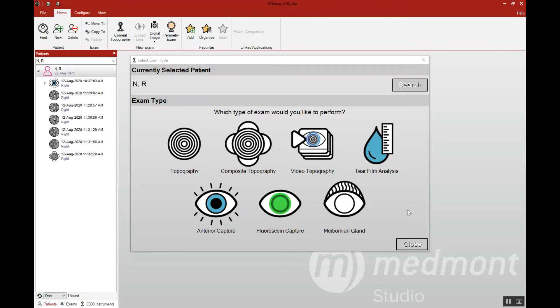This video reviews the tear film analysis that you can perform with your Medmont topographer. One of your options is the tear film analysis, a non-invasive option for assessing the tear film breakup time.